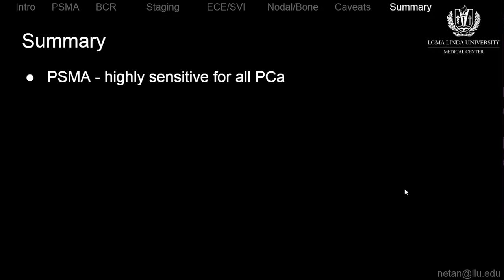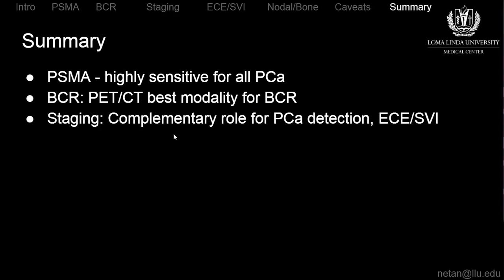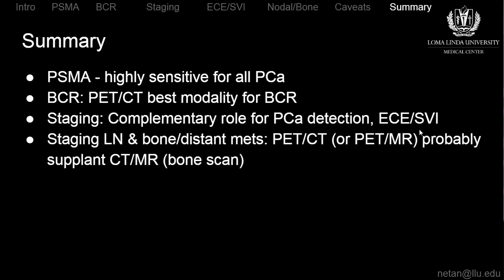So in summary, PSMA is highly sensitive for all prostate cancer, which can be useful if local therapy such as HIFU is being considered. For biochemical recurrence, PET-CT is probably the best modality. At this point, it's unclear what the added value of MRI is. In staging, though, PET MR may play a complementary role for prostate cancer detection as well as evaluating T3 disease.